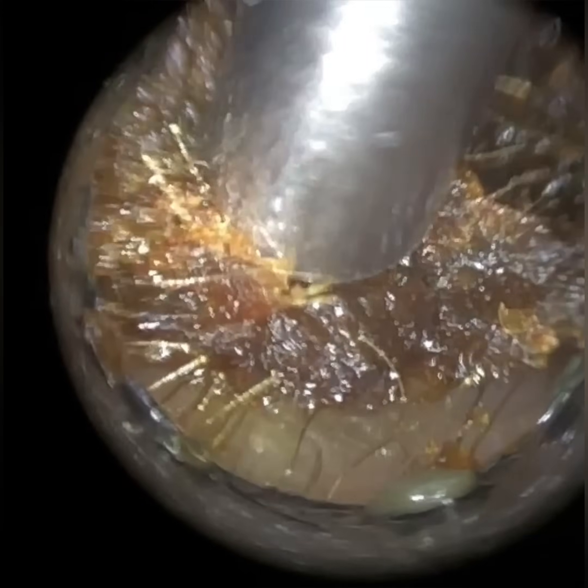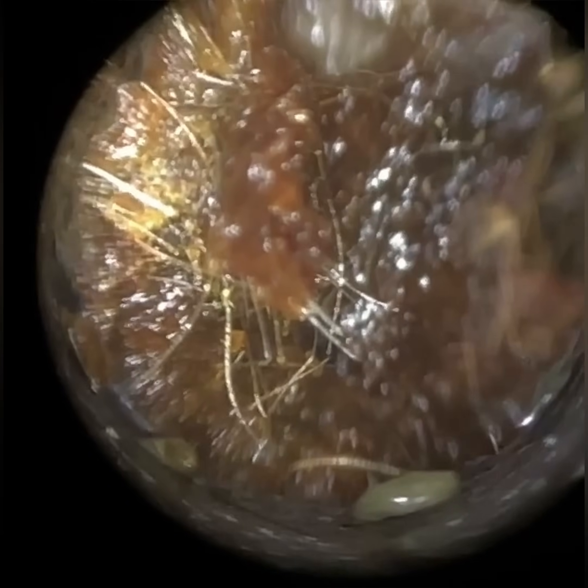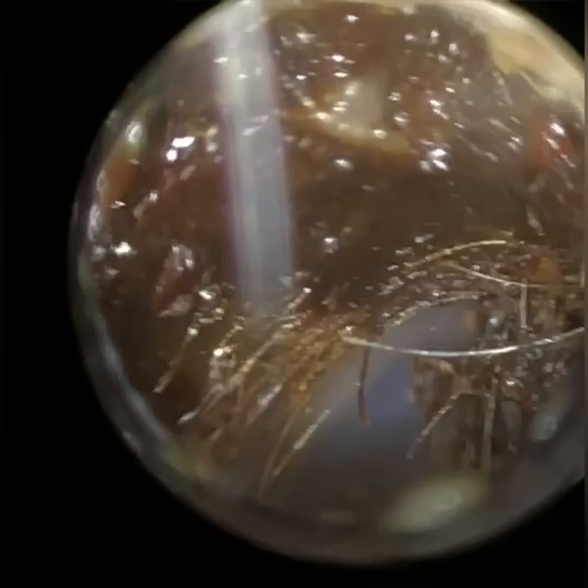The Waxscope image is clear but slightly different to the endoscope. With an endoscope, you don't adjust focus because the tip is inside the ear — hence 'endoscope'. With the Waxscope, it's more like an ENT microscope; we can call it an exoscope, as the camera is actually outside the ear. That means you do need to adjust focus, but I prefer getting the speculum in position and then adjusting focus with my finger — the same principle as a microscope, but without moving your head forwards and backwards. Ergonomically, this is a big benefit: you're in a fixed position and just change focus with your finger, and you move the speculum with your wrist when visualising different parts of the ear.